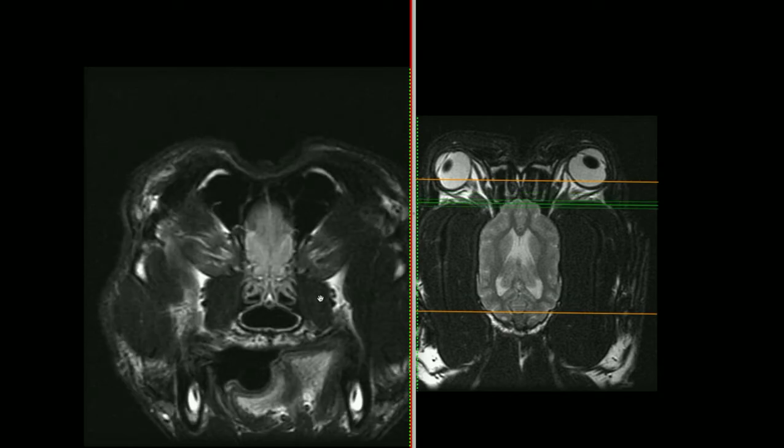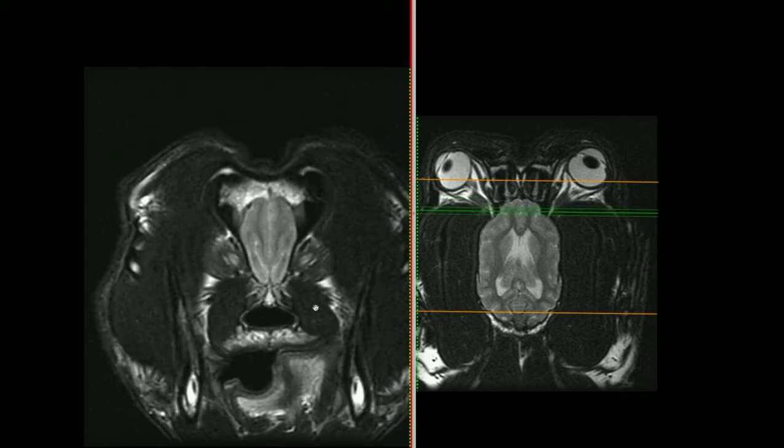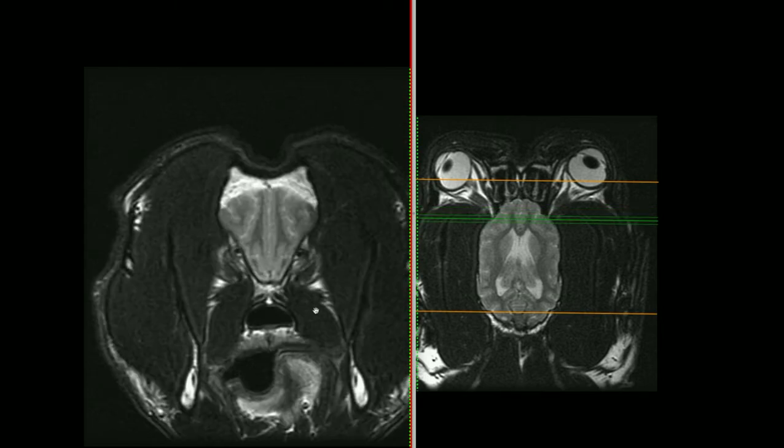So key questions we'd be thinking about in this case are, where do we think the neurolocalization is, particularly for ophthalmic disease and orbital disease. The localization of where we think the pathology is is quite important, because if we have pathology involving the cranial nerves, this can be really subtle, and we need to tailor our MRI study to have high resolution sequences, often with fat suppression, to be able to visualize the pathology.